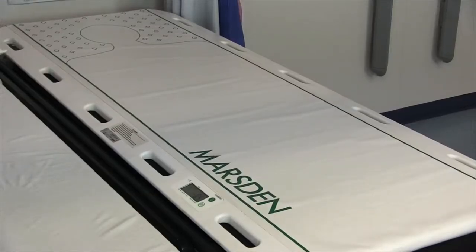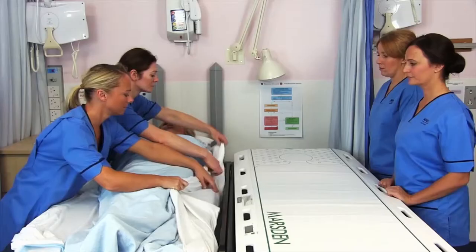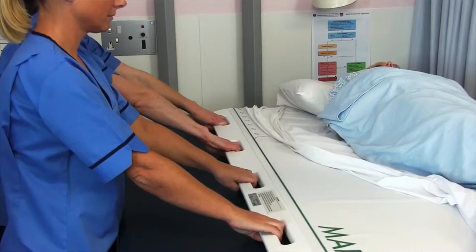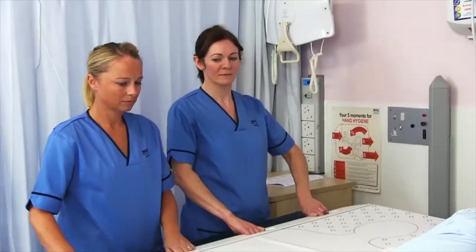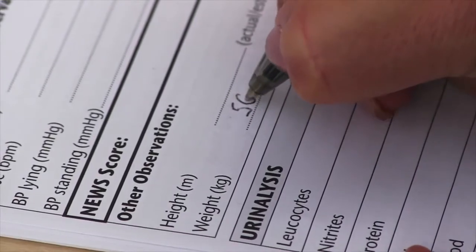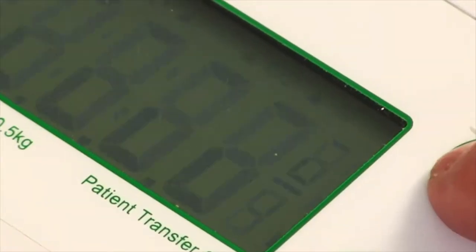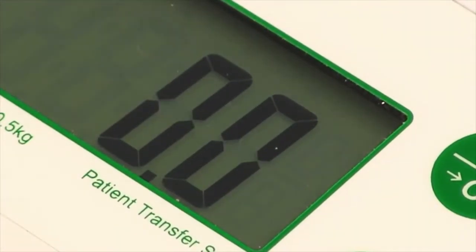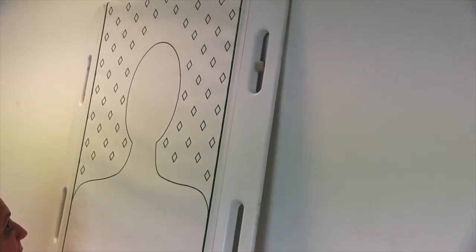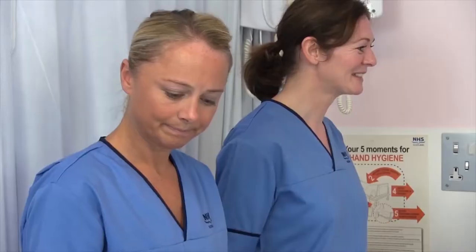The patient transfer scale is a transfer slide with an inbuilt weighing scale, which means you get an accurate weight reading during the transfer process. It means the weighing process is less stressful and more dignified for the patient, and you can administer medication with confidence. It's Class 3 approved and MDD approved, powered by an internal rechargeable battery and is supplied with hooks so you can wall mount the scale for when it's being charged.